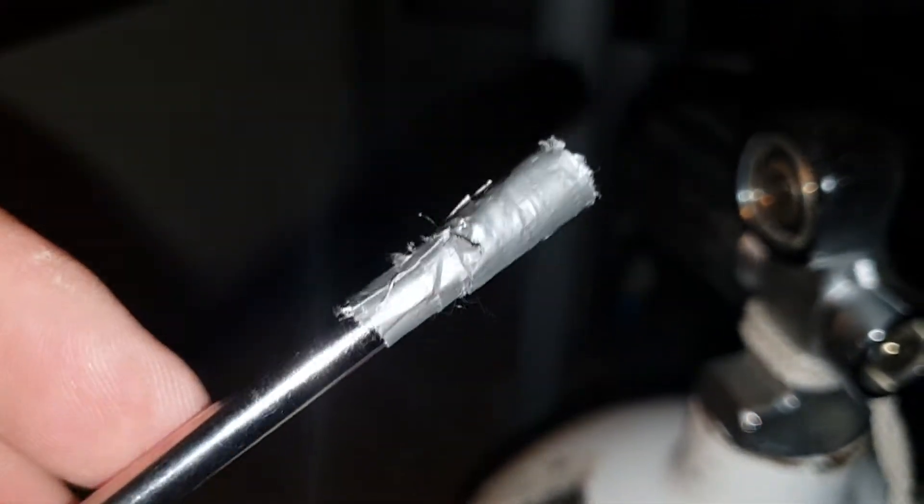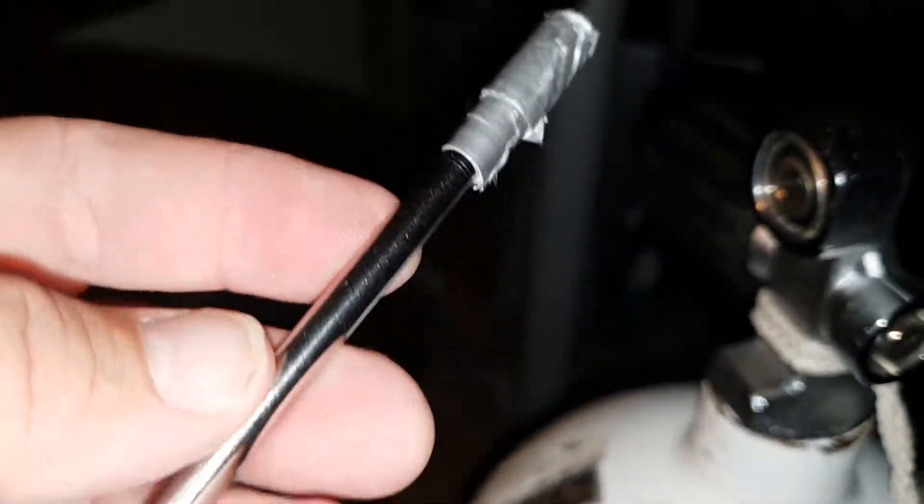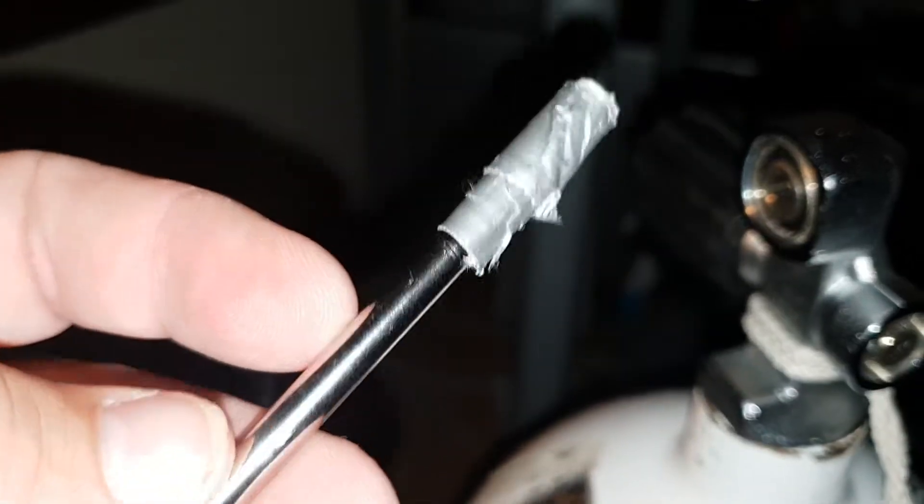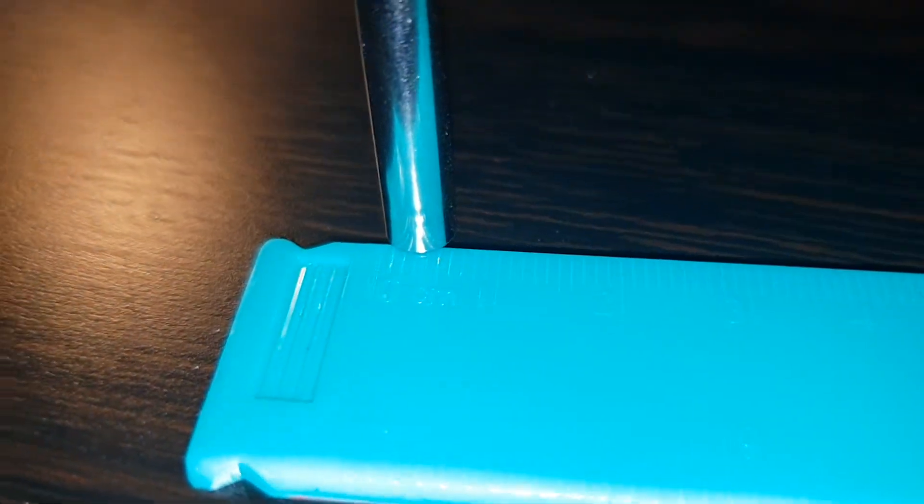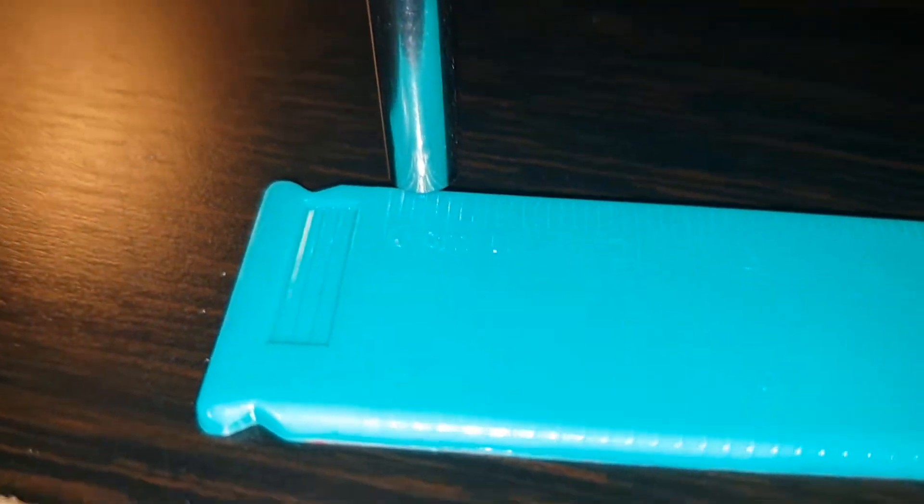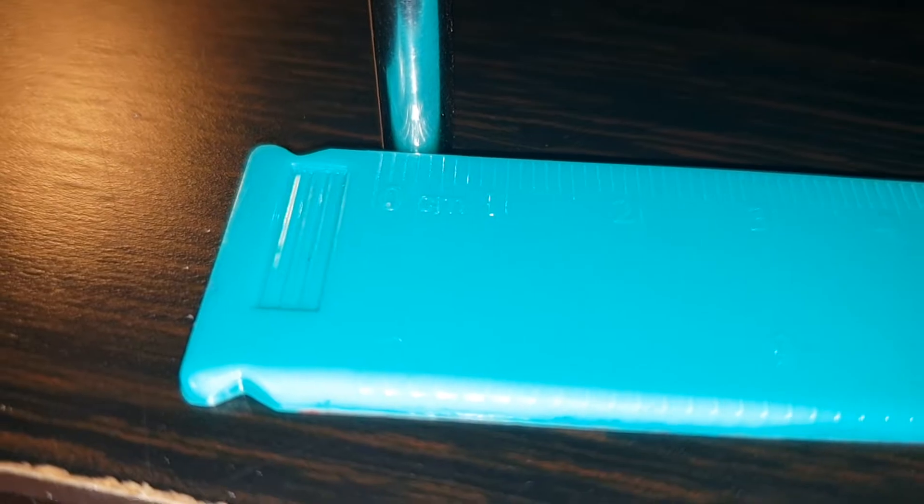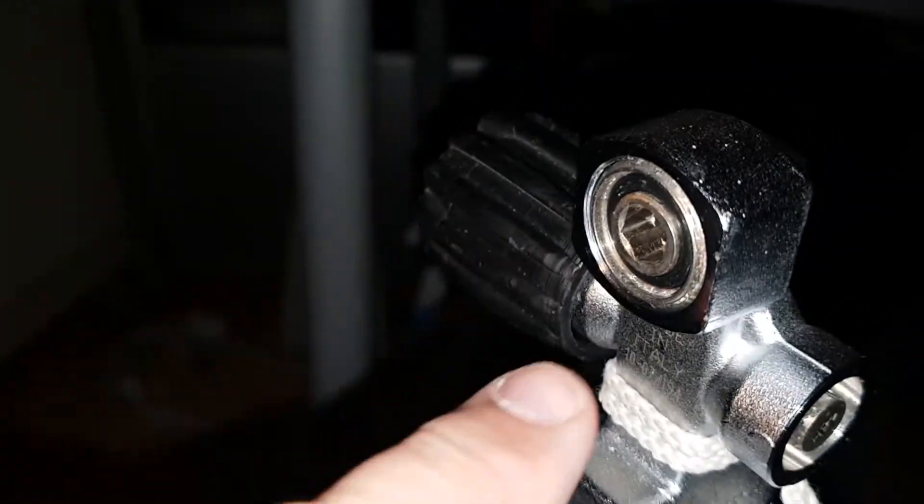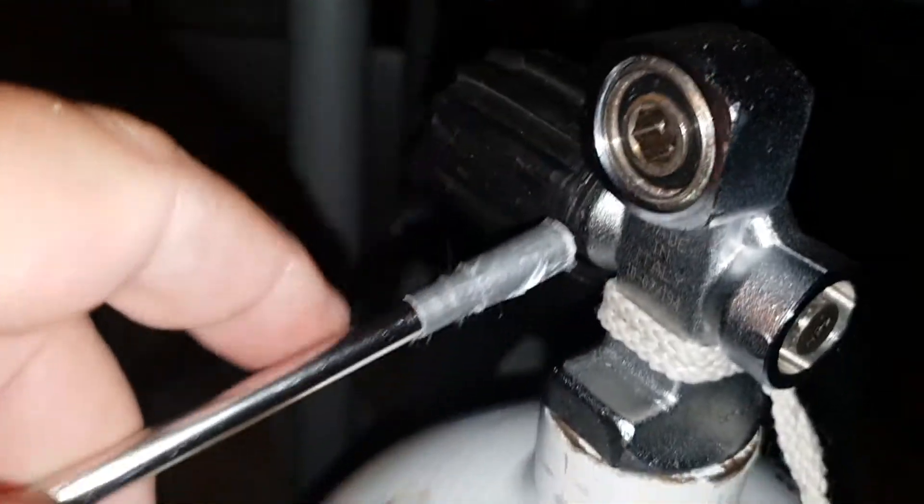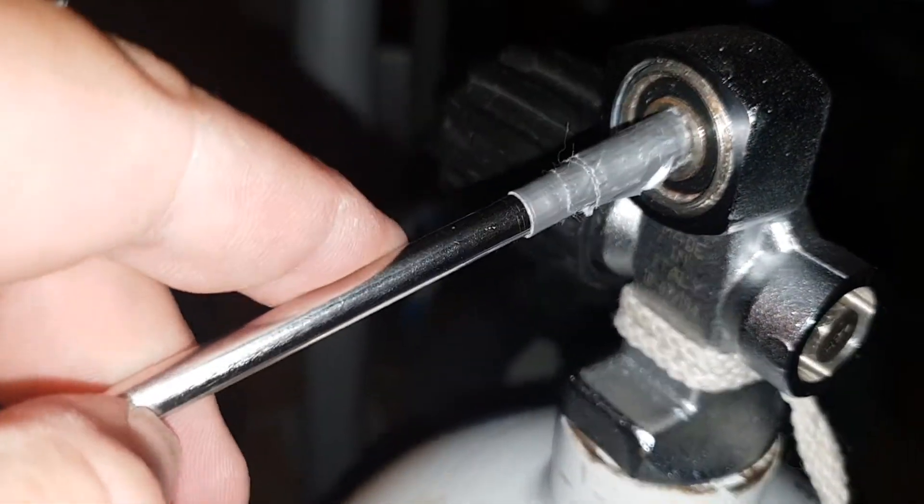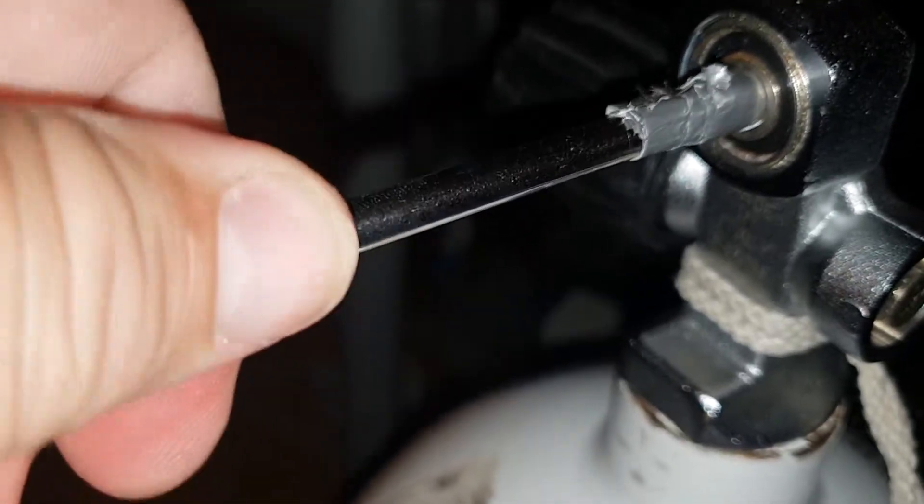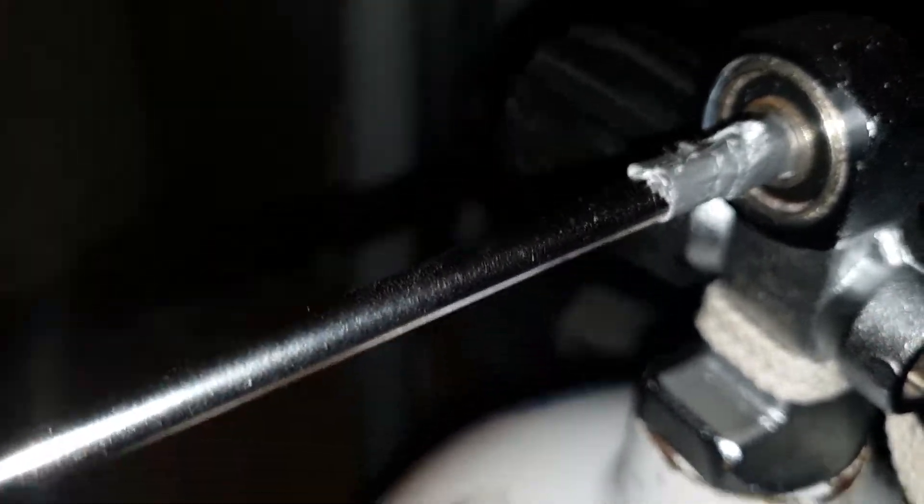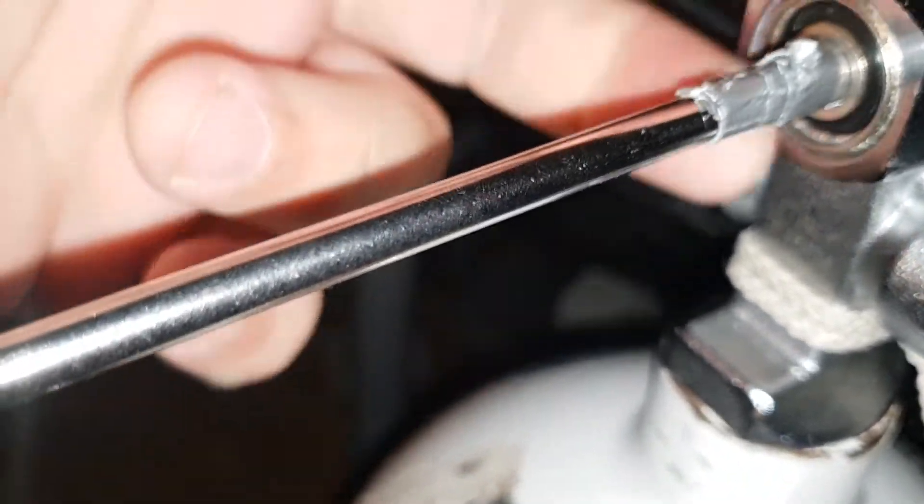...then what we can do is 3D print an insert. Now this is my mock-up, it's a drinking straw, a metal drinking straw. I don't know the exact size. There you go, the drinking straw is about five mil. So if we printed up a 3D piece and gave it a hex profile, it could go in here and you could use a bit of PTFE tape or you could use an O-ring to hold it in place.